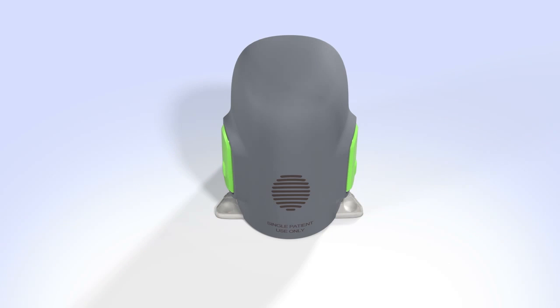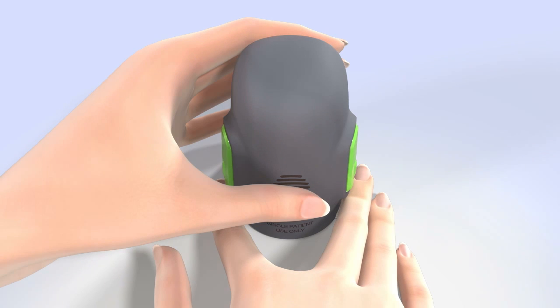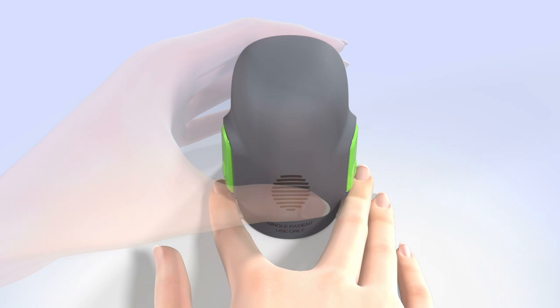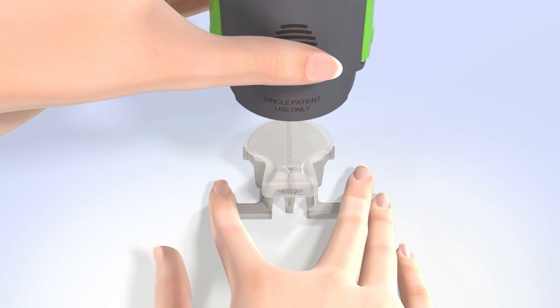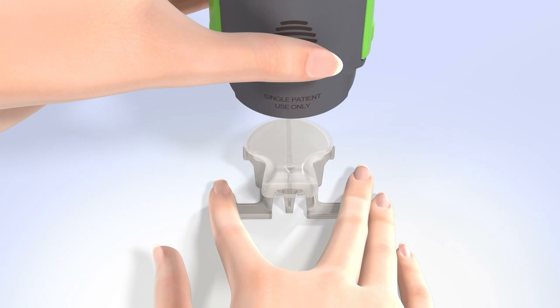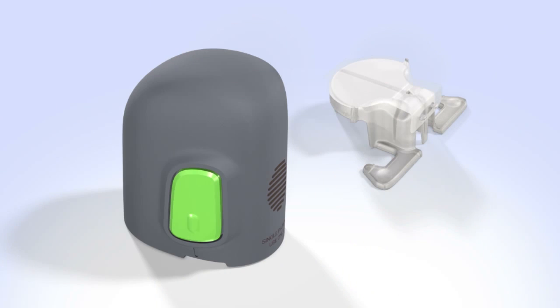To detach the serter from the pedestal, be sure your thumb is still placed on the thumbprint and you are not touching the buttons. Place two fingers on the pedestal arms, holding it in place, and slowly pull the serter straight up. Do not detach the pedestal in mid-air, as doing so might damage the sensor. After the pedestal is detached, the sensor remains inside the serter. This step also removes the adhesive liner from the sensor.